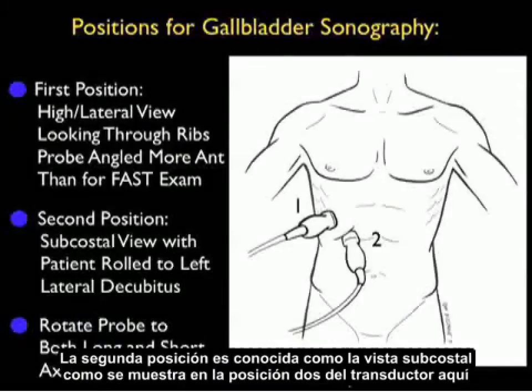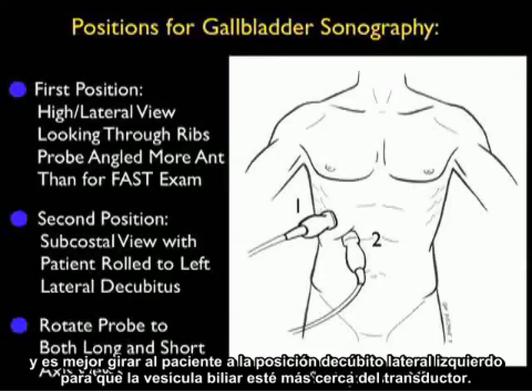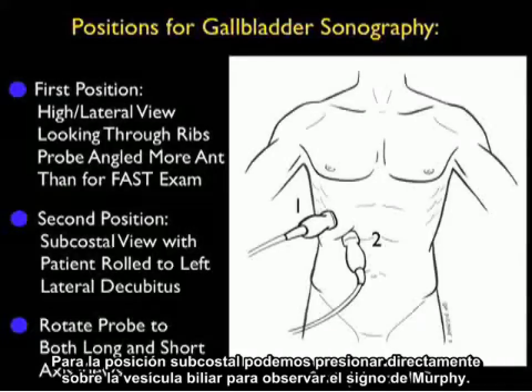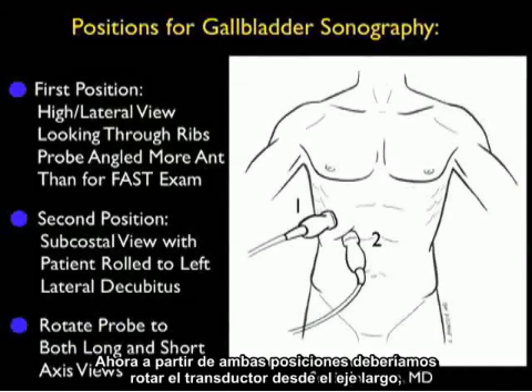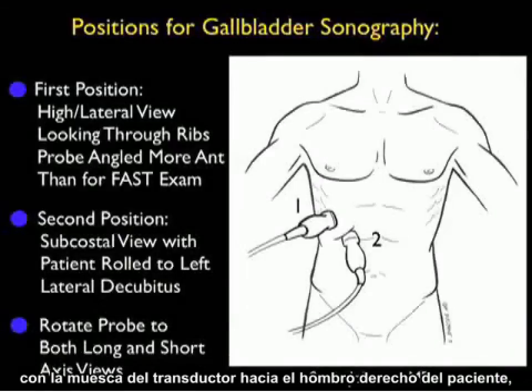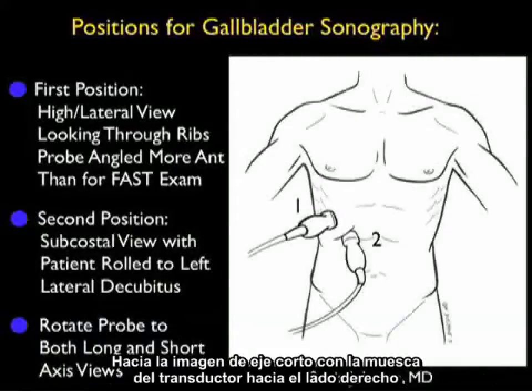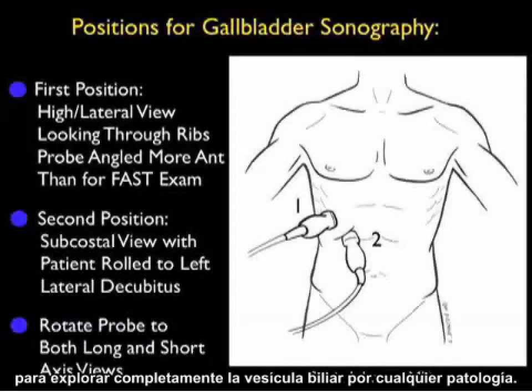The second position is known as the subcostal view. It's best to roll the patient into the left lateral decubitus position so that the gallbladder is closer to the probe. From the subcostal position we can push down directly on the gallbladder to elicit the sonographic Murphy's sign. From both positions, we should rotate the probe from long axis with the probe marker towards the patient's right shoulder to the short axis configuration to completely inspect the gallbladder for any pathology.